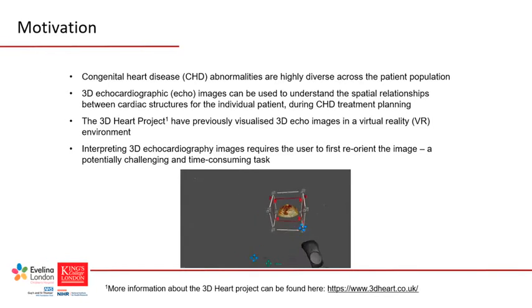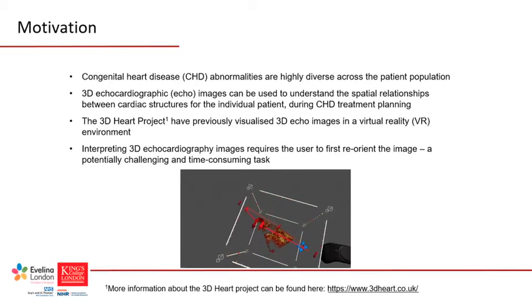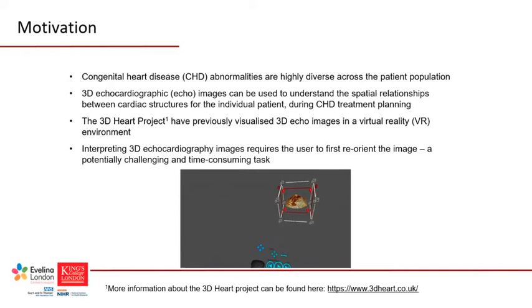3D echocardiography is used during CHD treatment planning, especially for more complex cases, as it gives a depth of field, unlike 2D images. 3D echo images can be challenging to interpret, especially since they are often viewed on 2D screens that do not allow true depth perception. To address this problem, the 3D Heart Project have previously visualized 3D echo images in virtual reality, which offers accurate depth perception in an immersive and interactive environment.